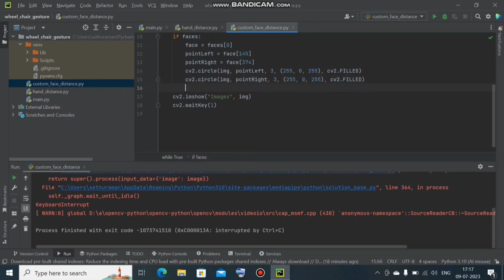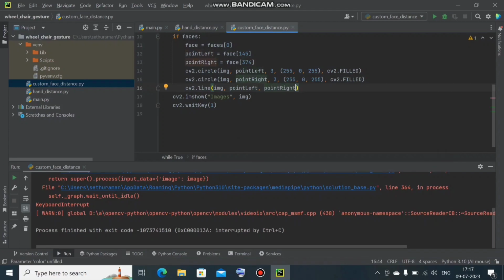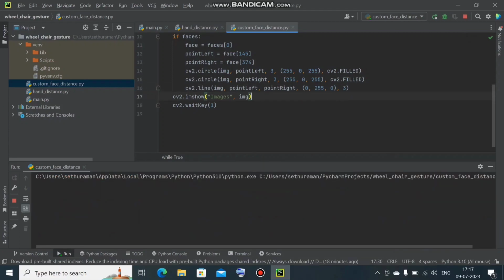Next I will draw a line between them. cv2.line, image comma point 1 is point left and point 2 is point right. Next color 0, 255, 0, thickness of 3. Okay, now you will see one line in between these two circles. The line will connect the two circles.